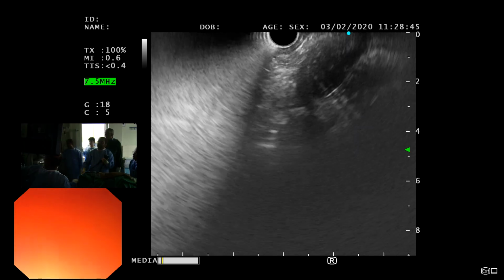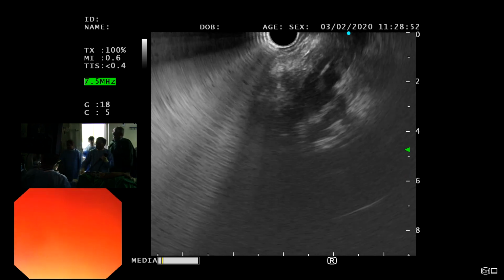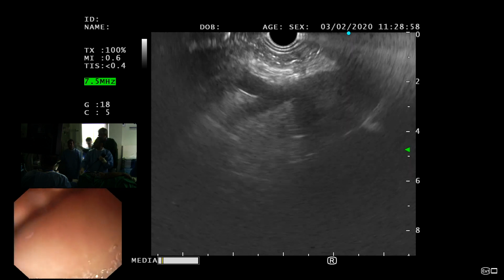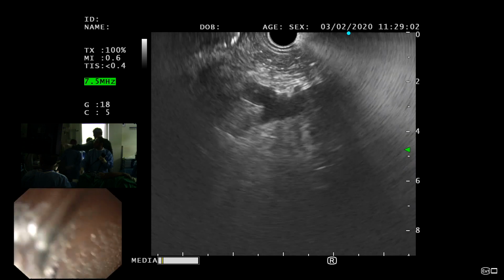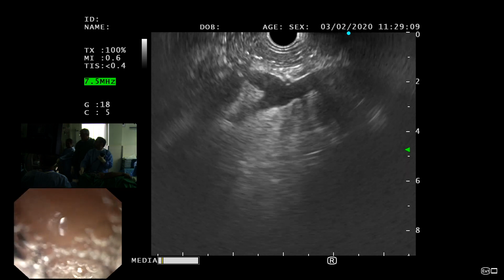So we identified the aorta. अब थोड़ा सा आप आगे जाएं. We have identified the kidney. We've identified the spleen, the pancreas, the distal pancreas, and body also is mostly atrophic. ये क्या है? This is a venous system. So I think this has to be portal system. हाँ, Yeah. portal system दोनों उसमें आ रहे हैं.